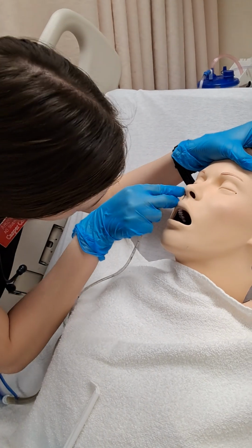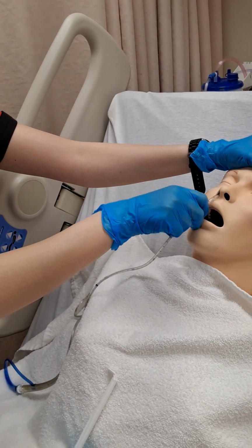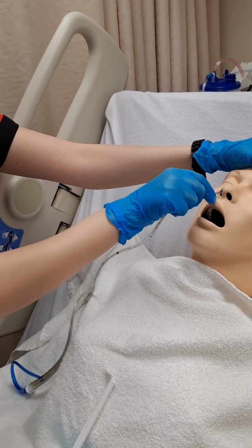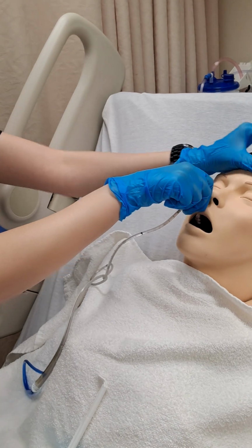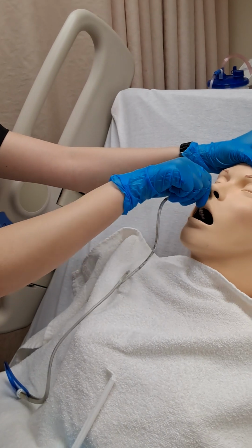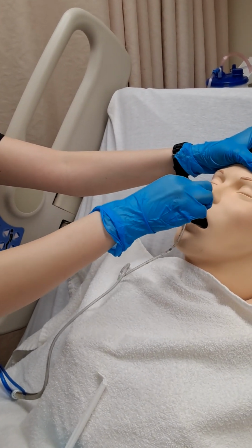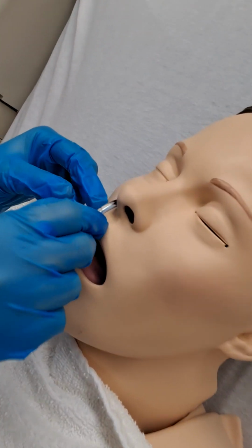I'm ensuring that the tubing is not kinked. Okay, so it's at the 52 mark.